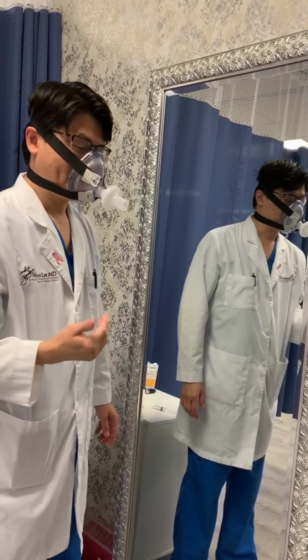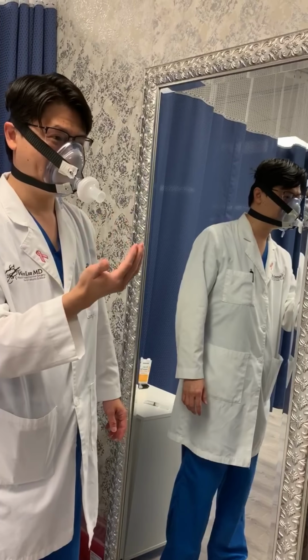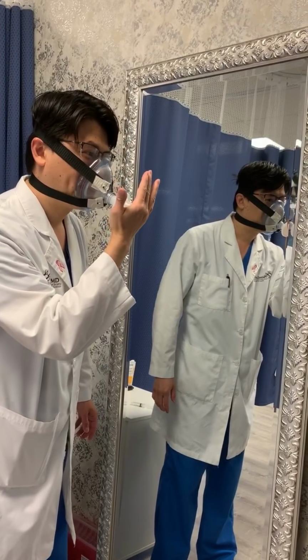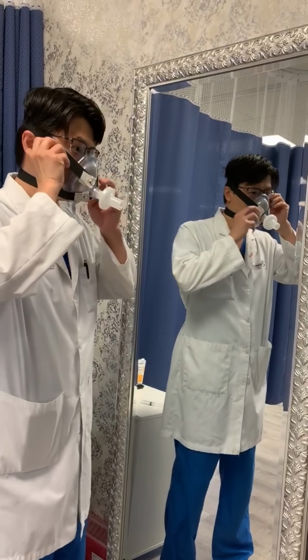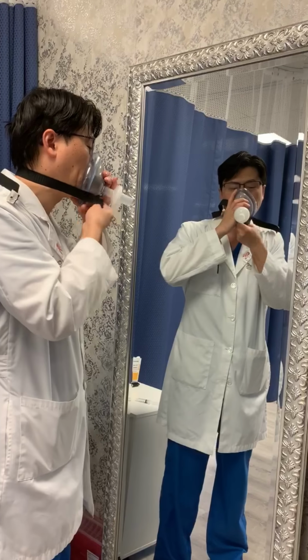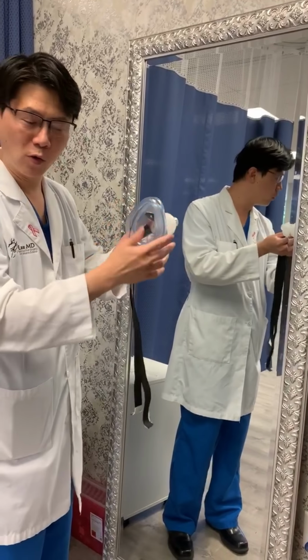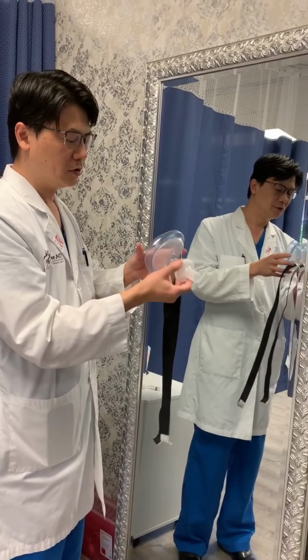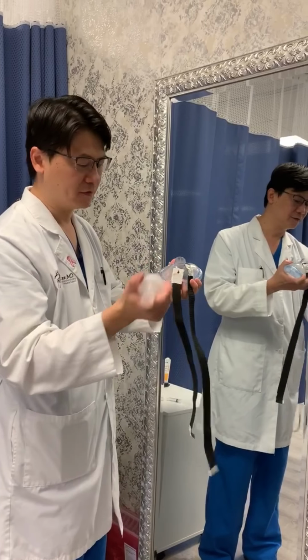Then you want to do an expiratory leak test. If you put your hand over the filter and you blow out, you shouldn't be able to expel any air. And there, I passed the leak test. And this can be disinfected using a CaviWipe or any disinfectant that you may have. And you can reuse this until it's soiled, or you can change out the filter when it's soiled.